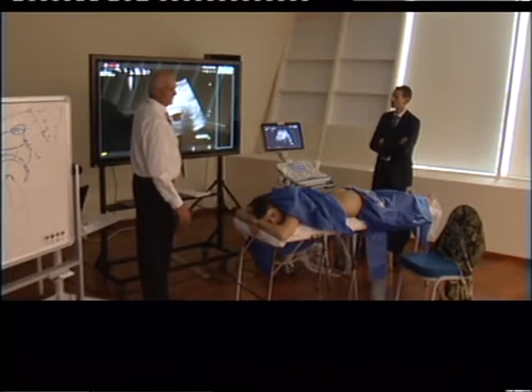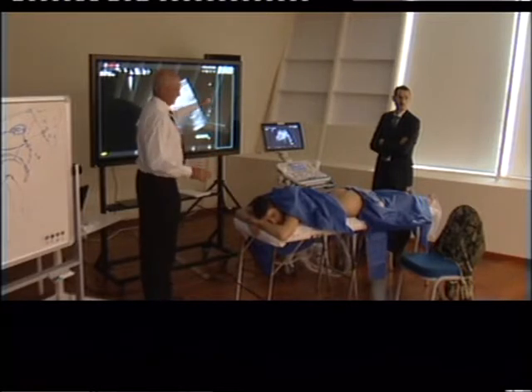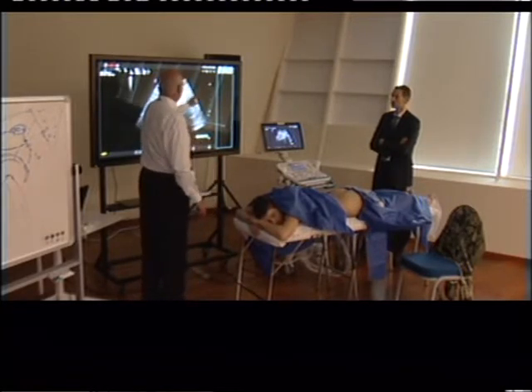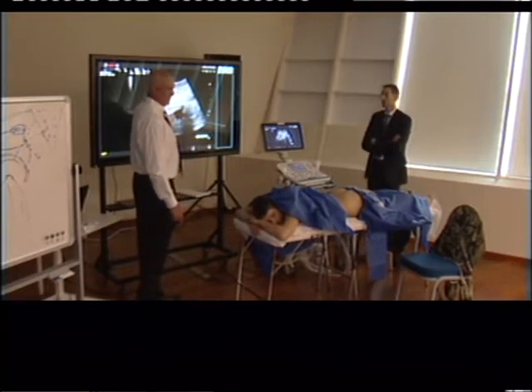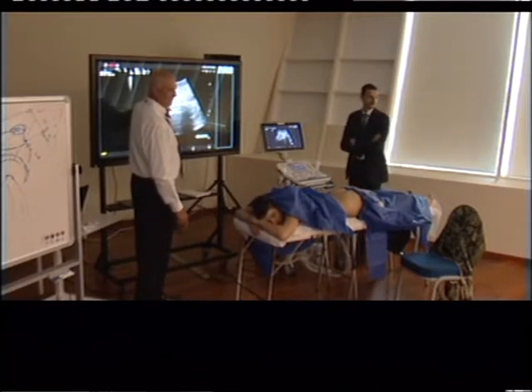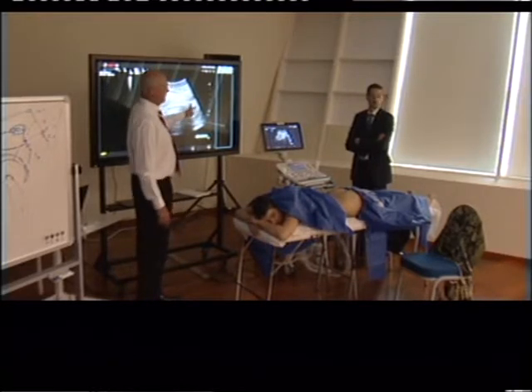Obturator internus. So now here's how we approach this with the needle, and we have to come in from the midline, cioè here, lateralmente. Because we have the nerves, so we can't come in this way. Non possiamo venire dall'esterno perché sennò c'è il nervo sciatico, il nervo cutaneo posteriore.